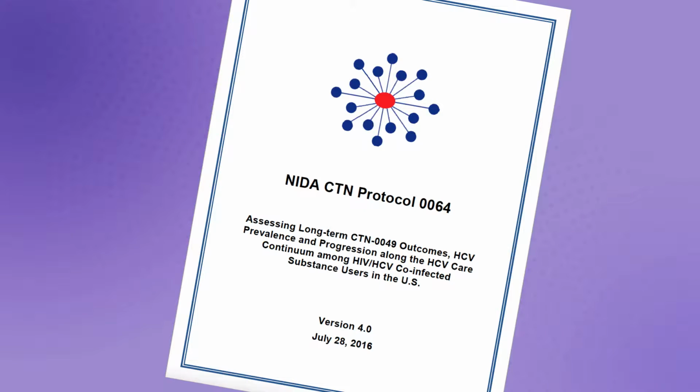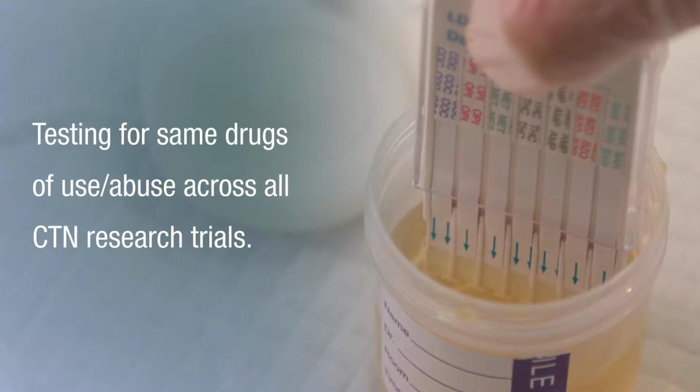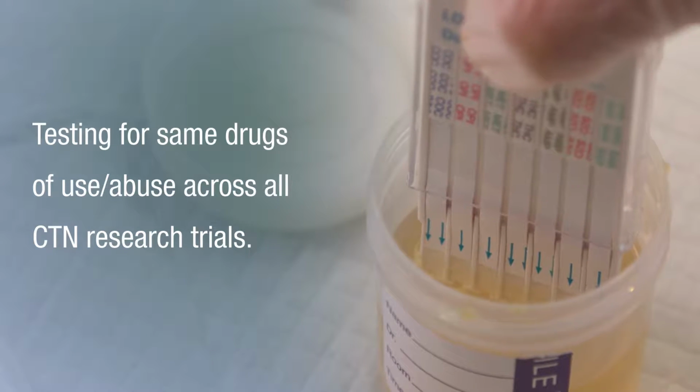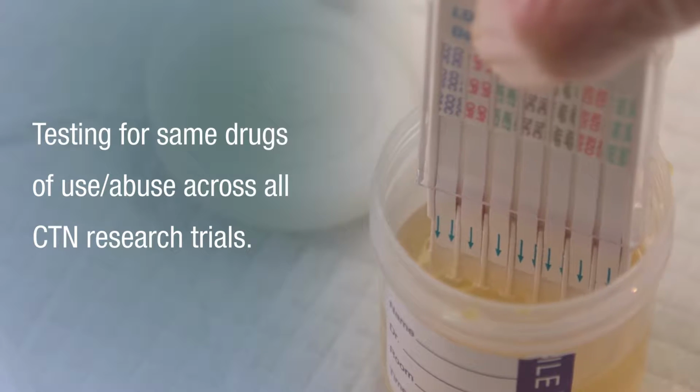It frequently is a primary or secondary outcome variable for the clinical trial, so it is an important assessment. Therefore, it is critical that you learn how to do the assessment precisely. The urine dip card used for the CTN studies tests for the same drugs of abuse across all CTN research trials, so that comparisons may be made between trials.